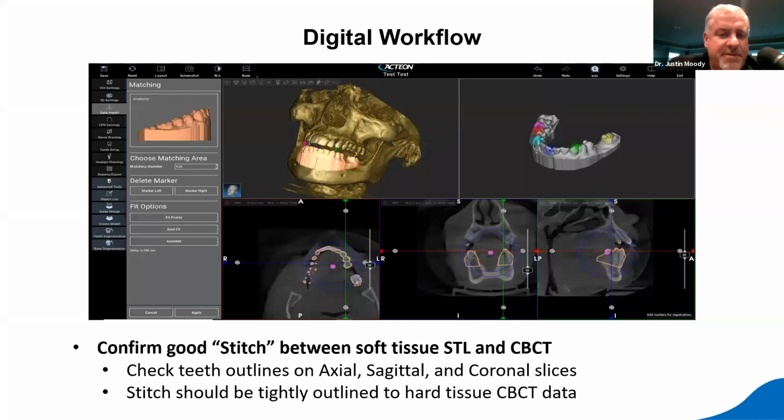If you have big gaps between these, you'll also have a big gap in the surgical guide, and it'll go to the accuracy of that guide. So we don't want the guides to be so tight that they won't fully seat. We also don't want the guide to be so loose that it rocks and it doesn't deliver the implant to the sites that we know to exist from the ConeBeam CT.